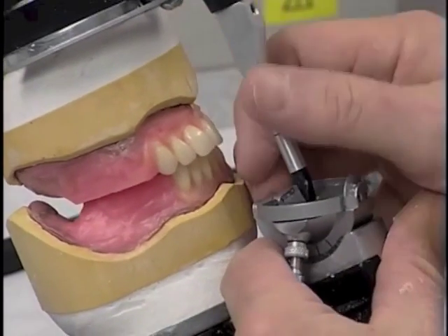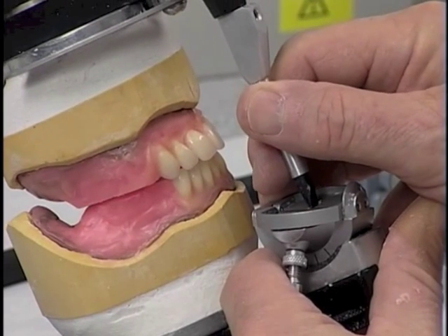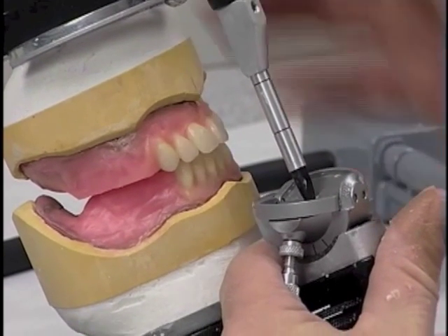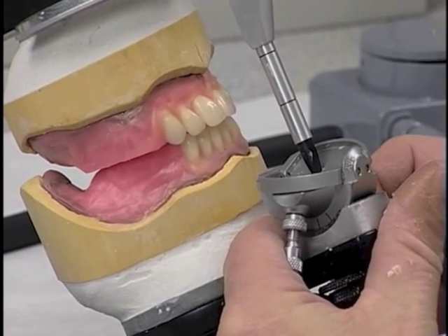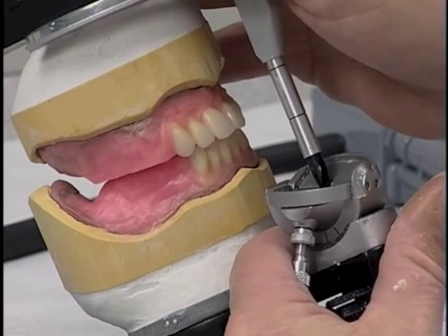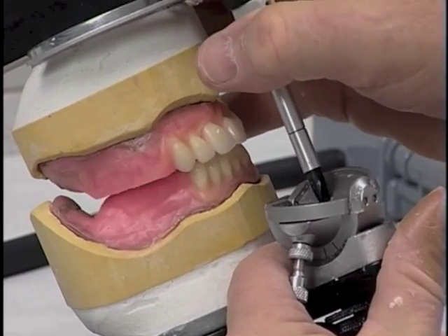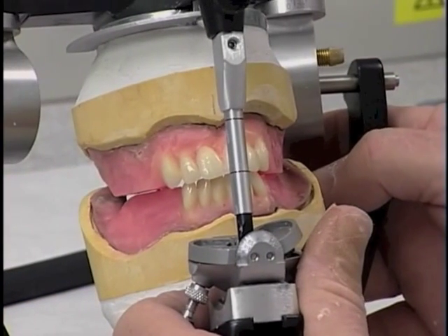Now let's find out what happens on the other side. We come across here and see it has a jump to it. The canines are causing it to jump a bit, so we can raise the wings of the incisal guide table to the point that there's no jump in those canines right there. Now it just barely moves, it's barely touching it. Just a little more. Now, it has free motion without it actually interfering as we go into lateral.